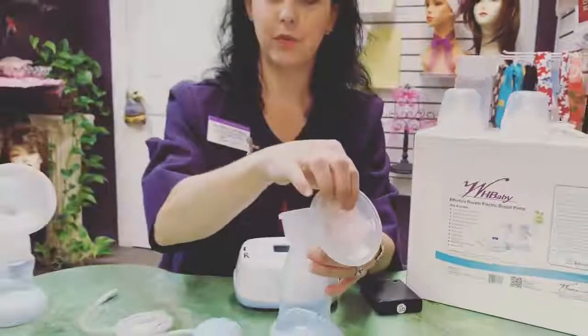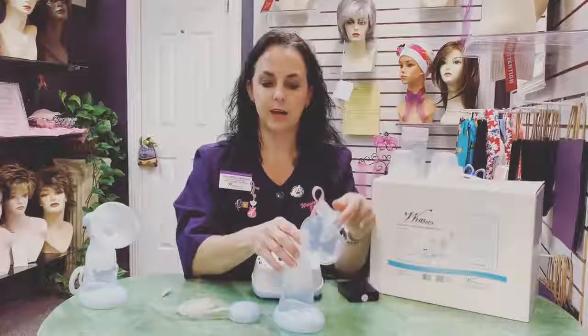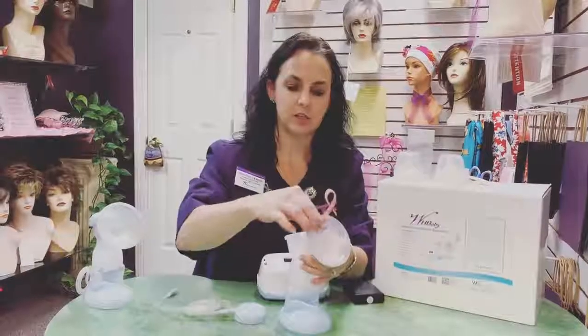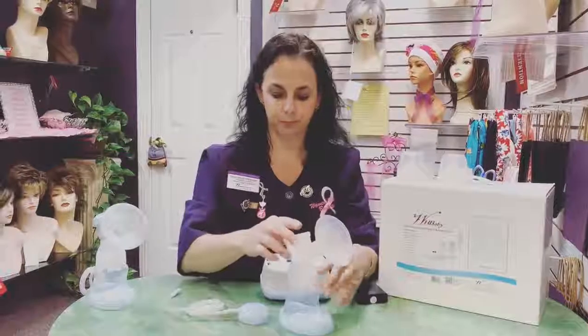When you put the silicone flange cover in, you get a 24mm flange. If you're a little bit larger, you can take it out and you can have a 27mm flange. It gives you a little extra room and a little versatility with this. It just gently goes on with the edge of your finger and it just slips right onto the flange cover.